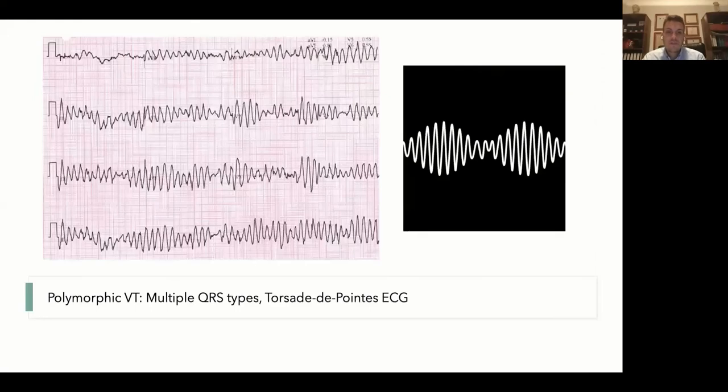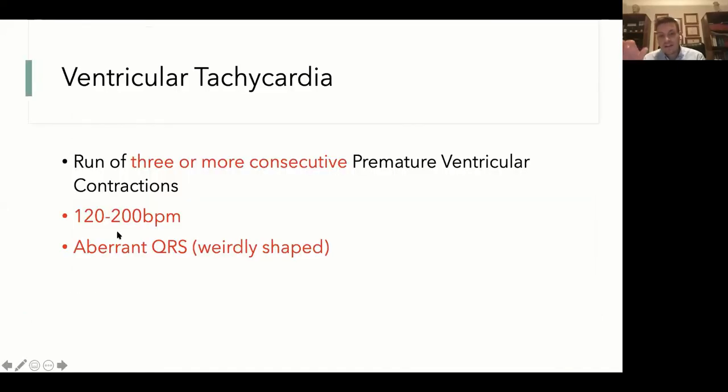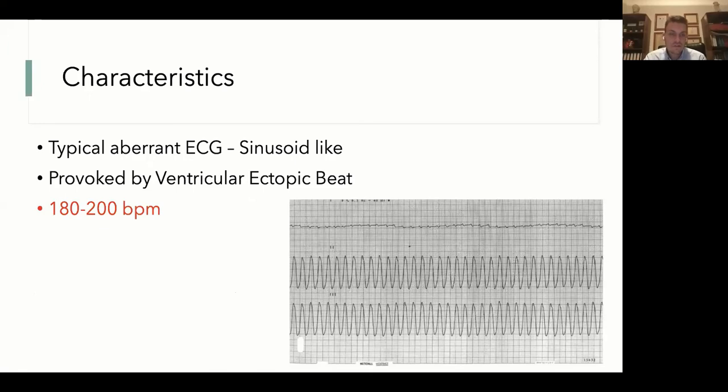They have some basic differences. The rate: a tachycardia can be at 130 beats per minute, a flutter is more around 200. If I were you, and what I still do, if it's less than 180, I talk about tachycardia, and I talk about flutter if it's around 200. Okay, thank you. You're welcome.